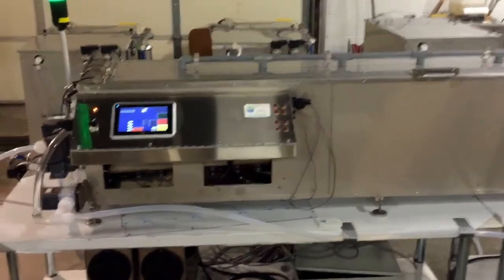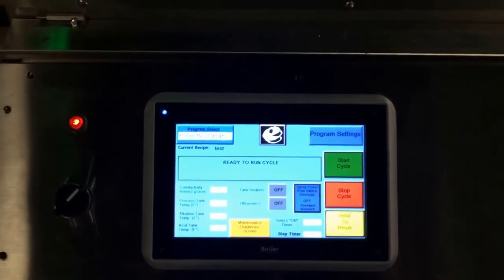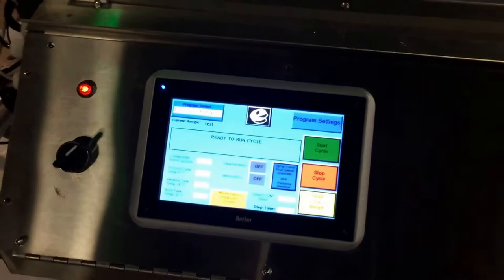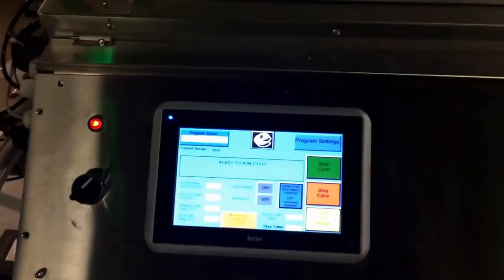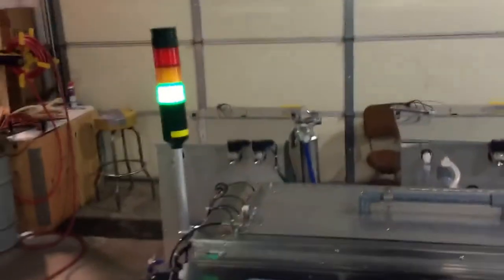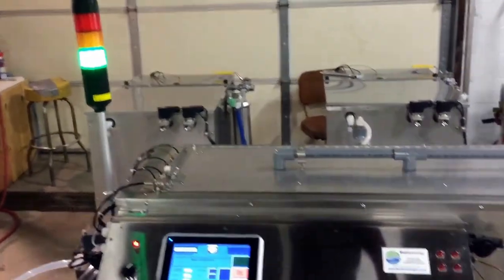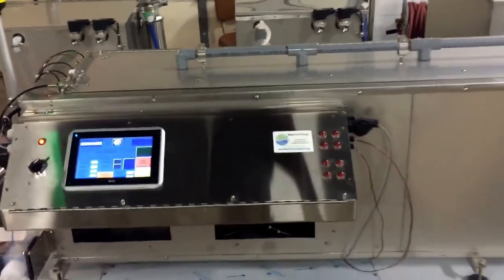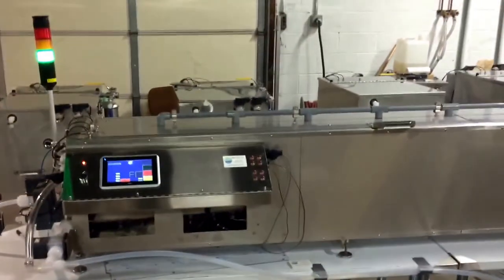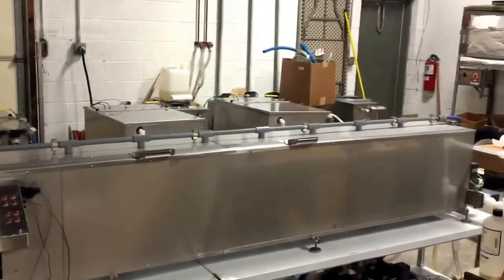The system is full PLC control with a touch panel interface. You can set up to 999 different recipes of wash, rinse, passivate, rinse, and dry, with variations of ultrasonic soak and cascade overflow. There is a light stack that can show errors, in-use, or ready-for-use status to operators across the clean room. This is a fully automated wash, rinse, passivate, rinse, and dry guide wire cleaning system.